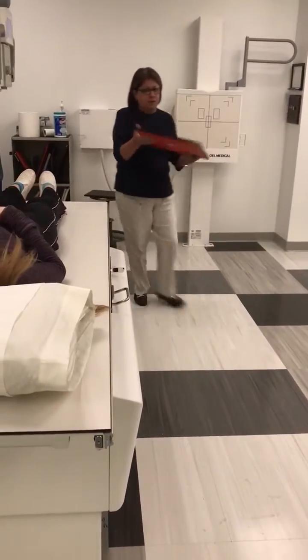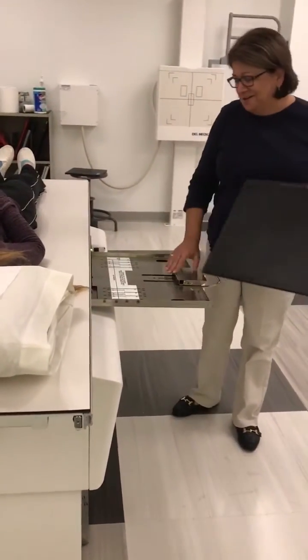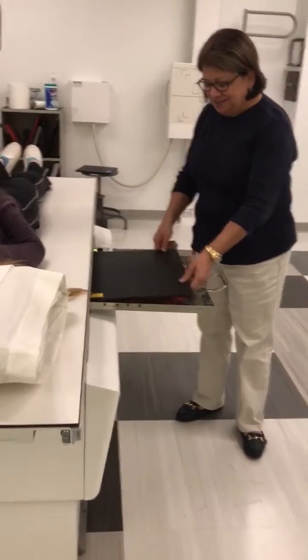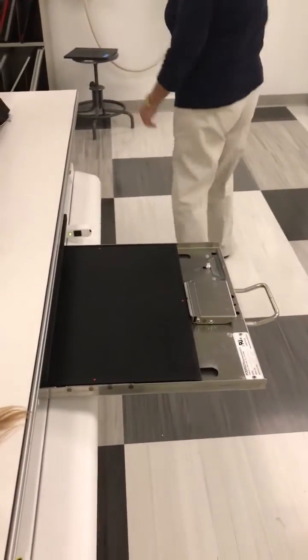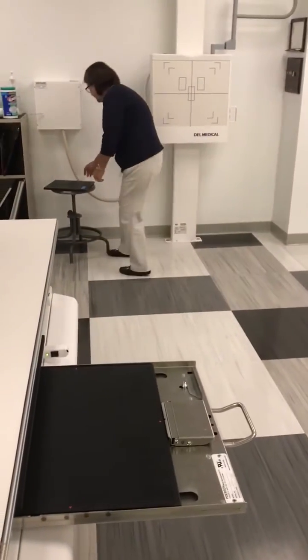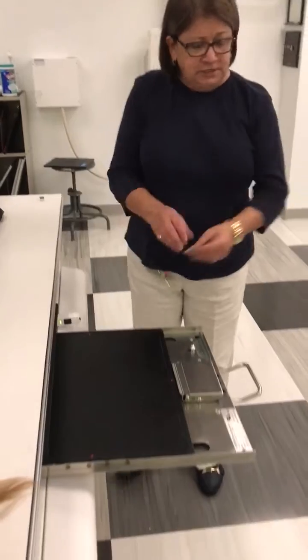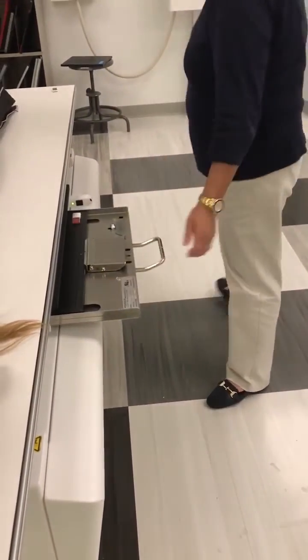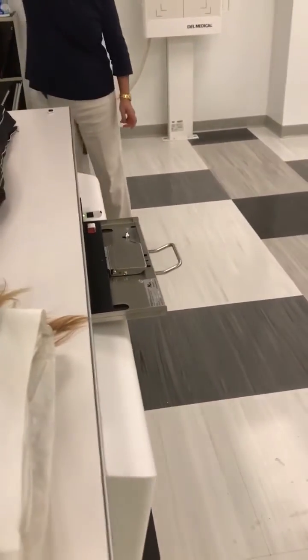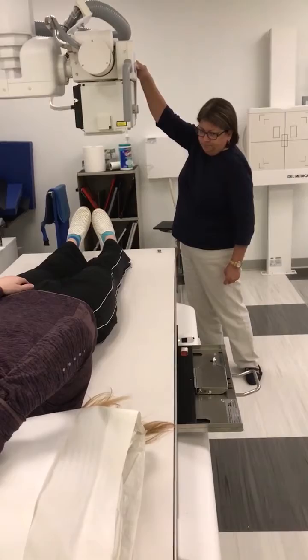I'm raising my table, the AP. Essentially it is a KUB using a 14 by 17 IR lengthwise. Placing my right marker inferiorly to the outer edge of the IR. Bringing my tube in transverse detent.